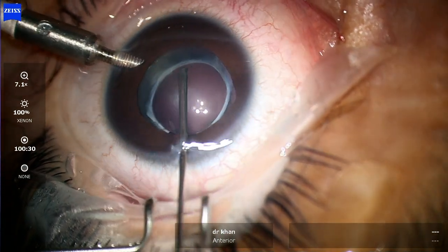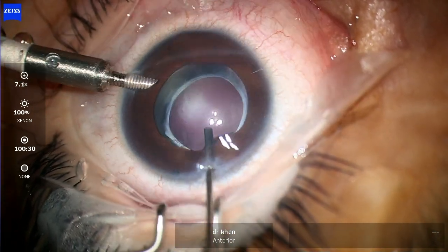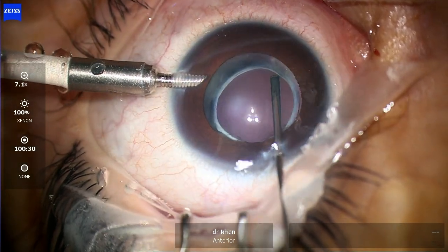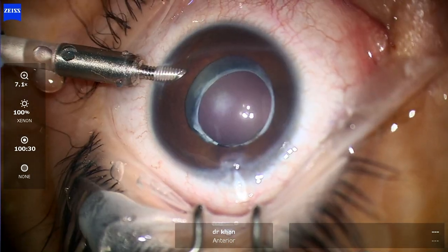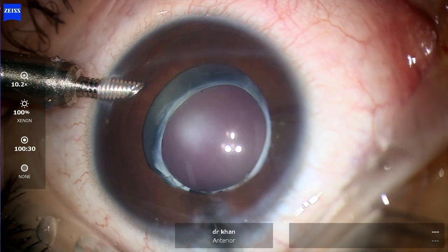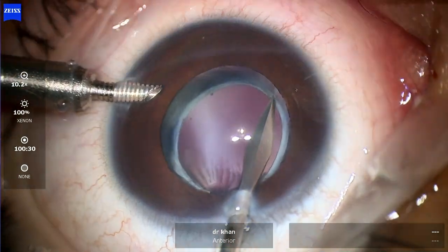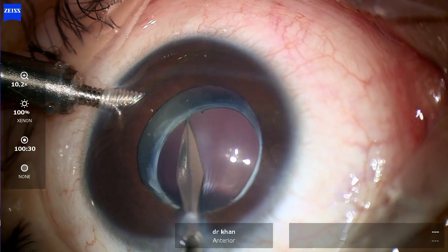You can also use triamcinolone to see if there are any vitreous tags that may aid in your visualisation. After doing the anterior vitrectomy and just staying at the surface of the anterior lens capsule, the next step would be to open up this capsular bag. I am using an MVR 23-gauge — the tip is really sharp, so just once you reach the edge of the anterior capsule, make small nicks.